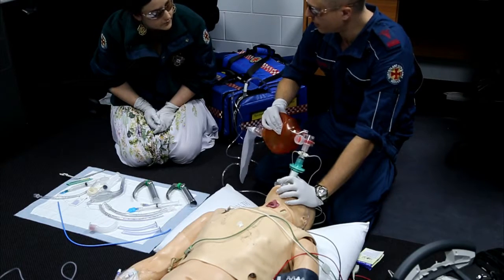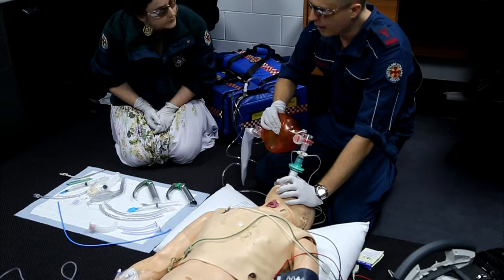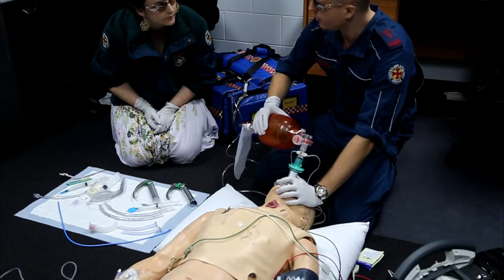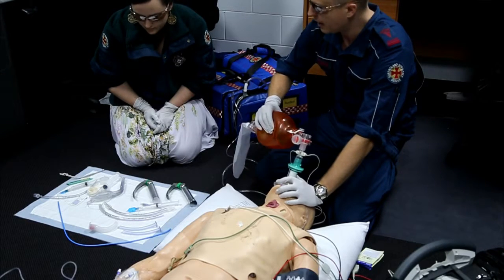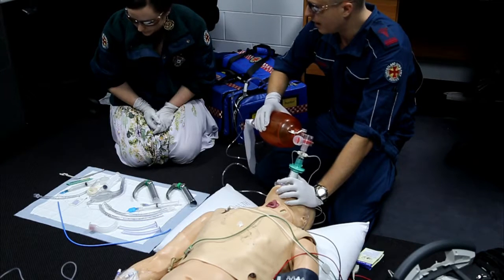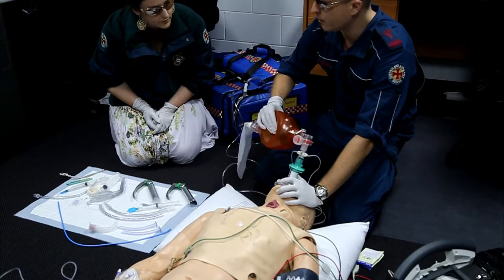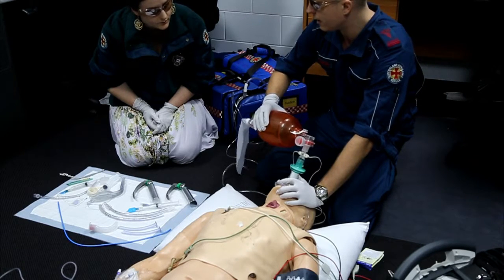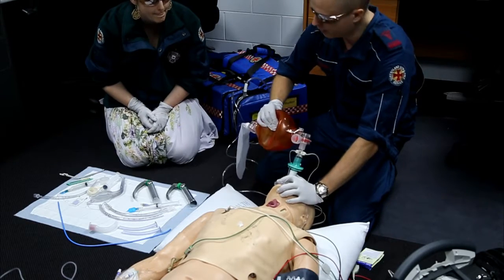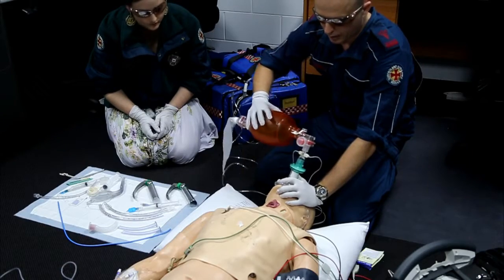We'll try and troubleshoot as we can, so perhaps some laryngeal manipulation. If we find that that second attempt doesn't work, we'll again return to a basic airway, and if that doesn't work, we're going to go to an LMA. And if we find ourselves in that position where we now can't ventilate and can't intubate, then we'll proceed straight to the surgical airway. Okay, are you happy with that plan? Yeah, absolutely. Okay, so I'm pretty much ready, are you? Yep. Alright, let's do it.